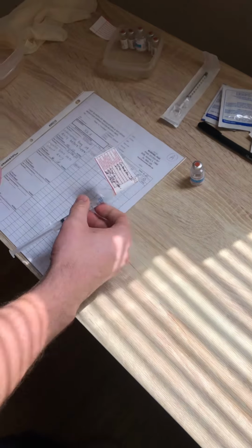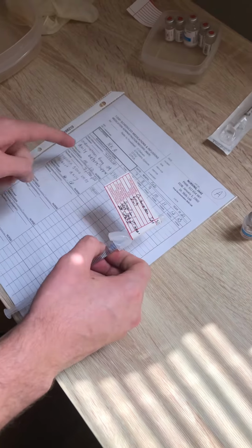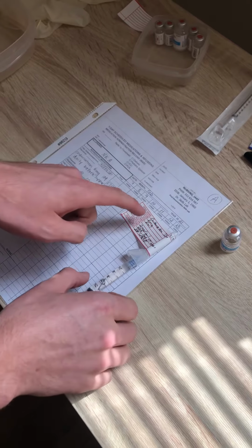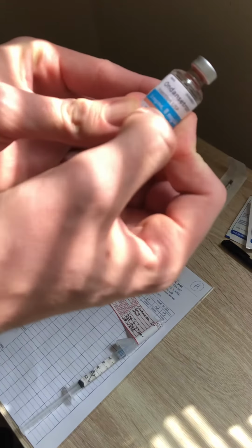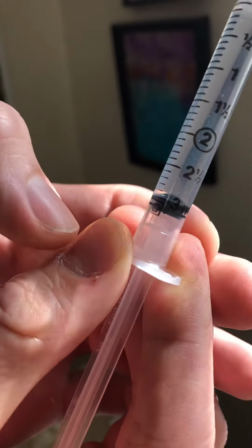So now I'm going to do my second check. Right patient, nursing Jake, right medication, ondansetron. Right dose is 6 milligrams. It's 2 milligrams per 1 ml, so that's why to get 6 milligrams, I have 3 ml. It's a little smudged, but you can see it right there.